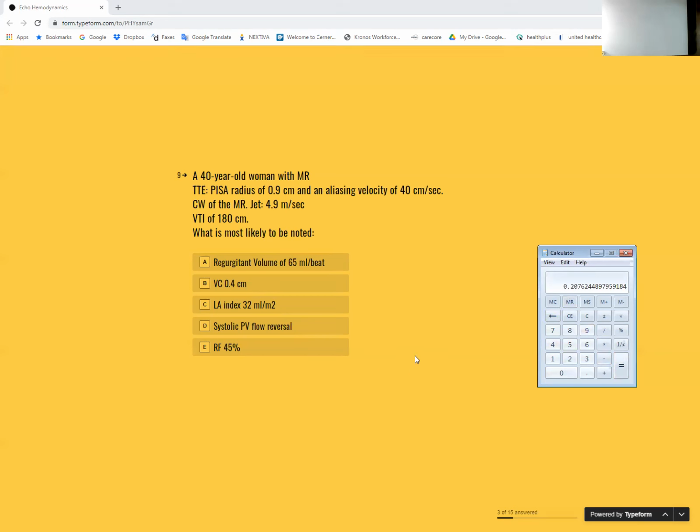So what would that make your regurgitant volume? Anyone? 75.